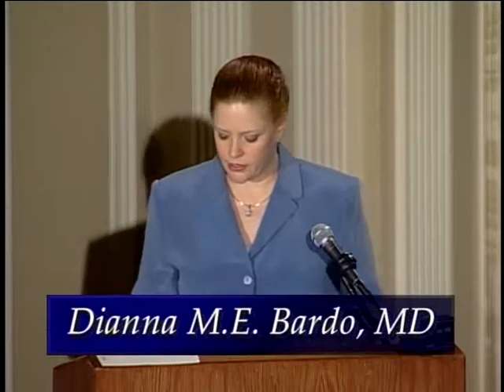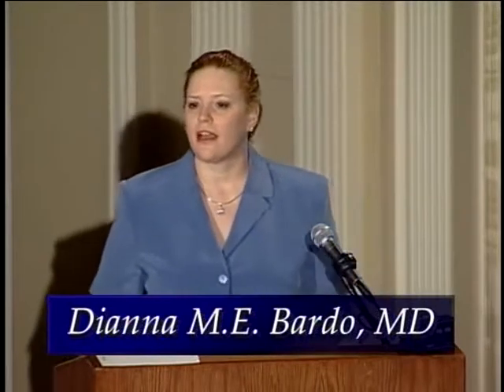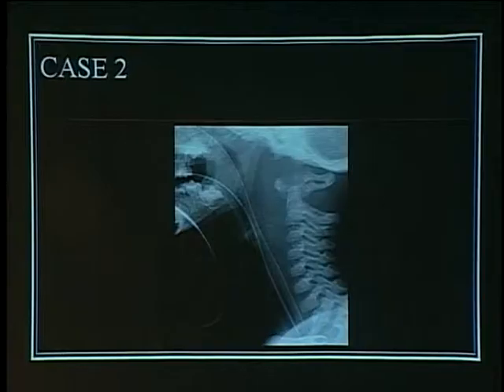All right, we're going to do this in a quick fashion because I have about 30 cases. I'm going to show you, in some instances, only a single image, and in other instances, several images on one slide, and then go through all of the unknown images first, and then go back through them again with the same images and a diagnosis. We'll talk about a few findings later as we go through them with the diagnoses.